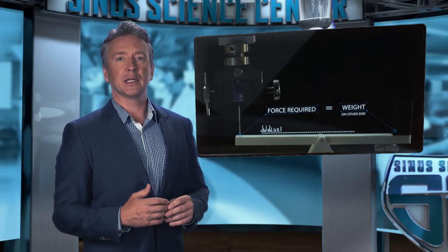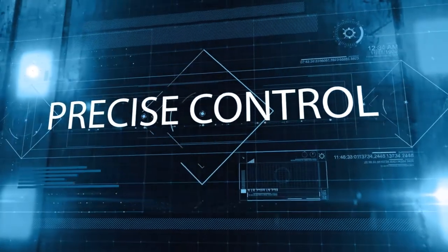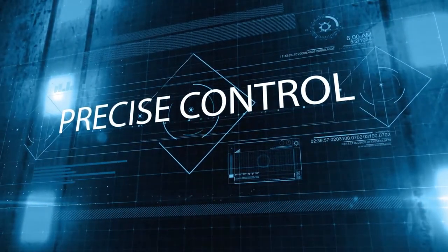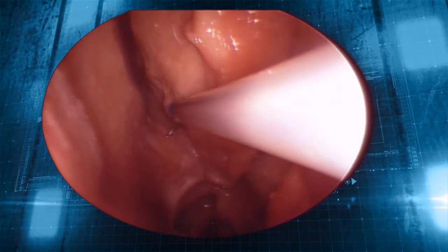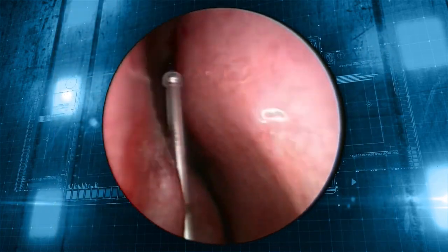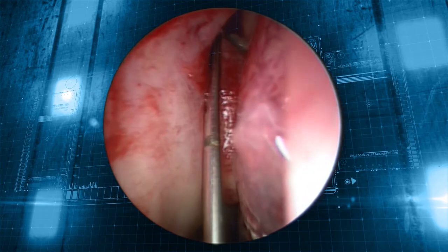When something more than sight is needed, increased tactile feedback offers a powerful technique advantage. A seeker-based balloon system also delivers the precise control needed to quickly access the sphenoid ostium. In the open cavity approaching the sphenoid sinus, there is little anatomy to bounce off, and the inflamed anatomy present provides a challenge in quickly finding the ostium target. But the seeker-based probe design allows for consistency in control, and with a seeker-based system, the physician remains in control of tip placement and search pattern.